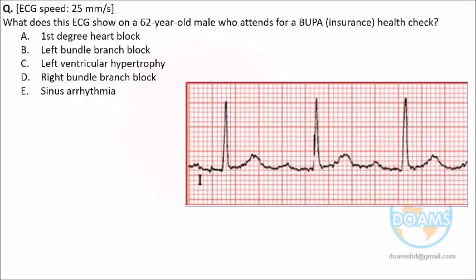First degree heart block. Reason is? Second degree, which PR? Second degree, doctor? Mobitz type 1, Mobitz type 2? I am not ignoring any answer, doctor. Don't think the first degree is wrong. I think Mobitz type 2. Dr. Kabir, what is your opinion? Is it Mobitz type 2? I'm telling you, this is the P wave, not a straight line, wavy, maybe a shivering patient. This is P wave, this is P wave 2. The duration is the same.